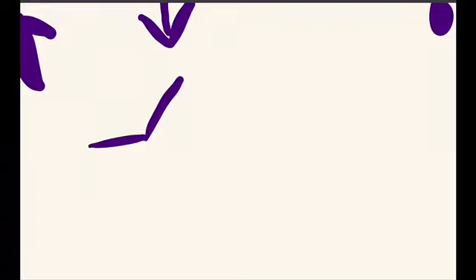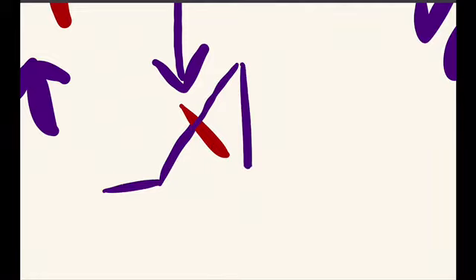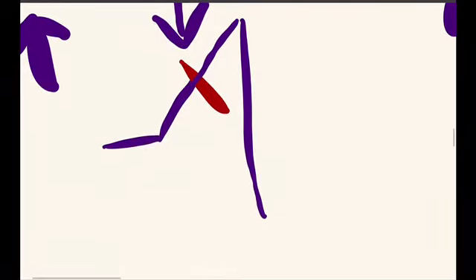Now the vector is going more towards the right side. That means this part of the R wave was because of the septal depolarization, but now there will be more R wave because of the ventricular depolarization, as the vector is going more towards the right side. And then the S wave will be there, and then the baseline will be achieved.